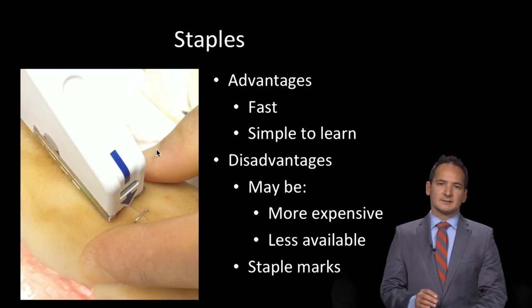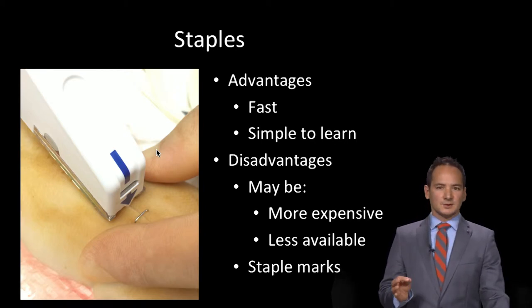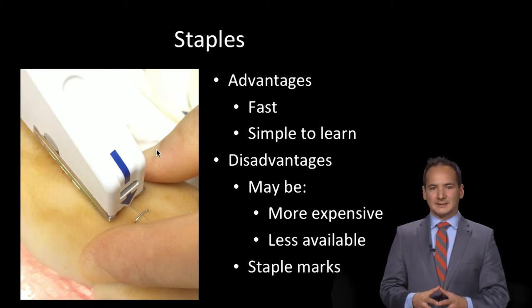Another great technique that we often forget to take advantage of is that of staple use. Staples are nice in the sense that they're fast, they're simple to learn. They're great for areas like the scalp or hair-bearing areas where it's hard to get your sutures in and hard to see the suture material that you'd be tying.